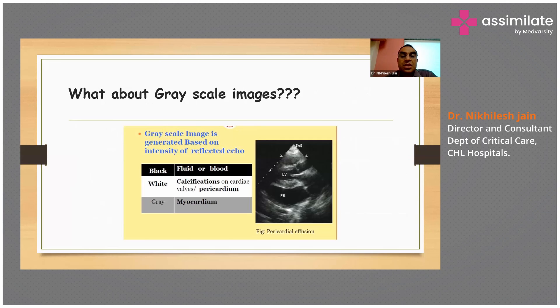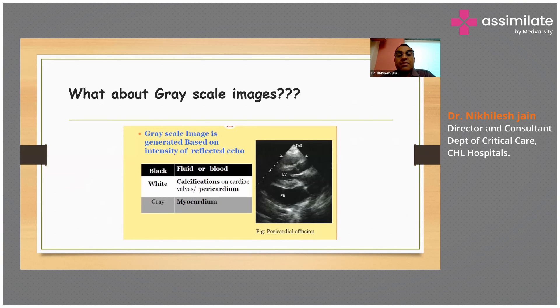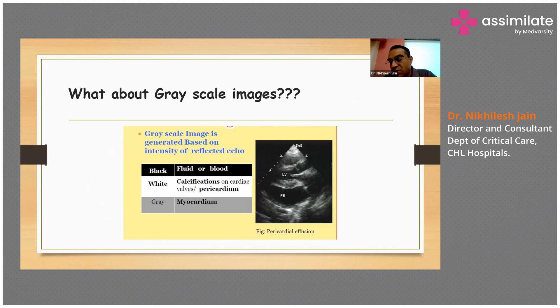This is called a gray scale image. The gray scale image is actually generated based on the intensity of the reflected echo. If there are calcifications or if it is pericardium, it would be reflected as white. If it is fluid or blood, it would be reflected as black. And if it is myocardium, that would be seen in gray color. That is how the reflected image looks.